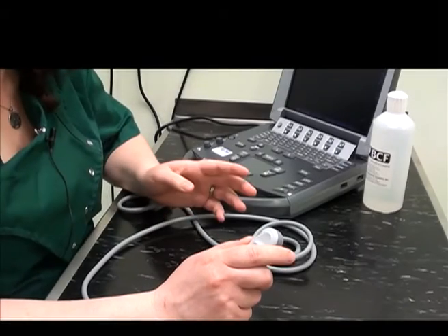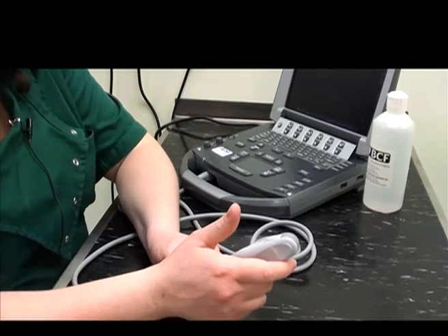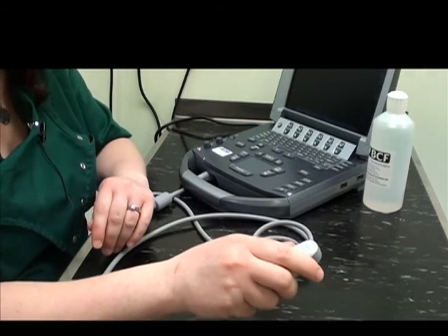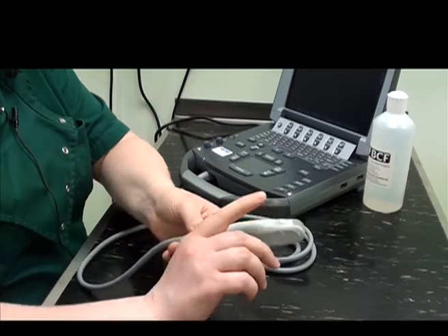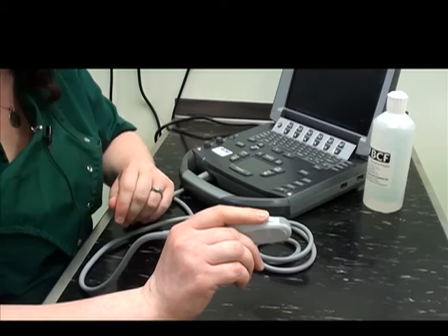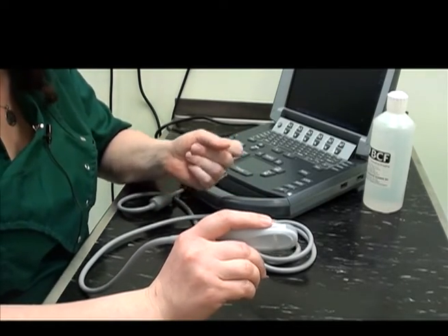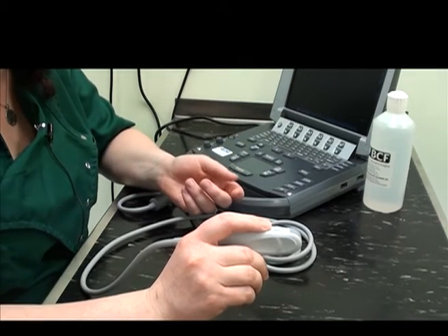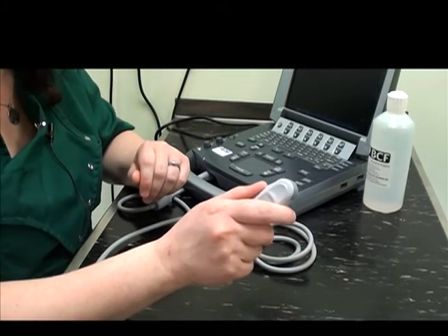There are two basic grips that you can have on the ultrasound probe. The first is placing your thumb on the marker and grasping it lightly with the remainder of your hand. The other grip is the pencil grip, where you put your index finger in the groove near the marker. Whichever grip feels most comfortable is the one you should use, and you might actually use them interchangeably throughout the entirety of the abdominal ultrasound exam.